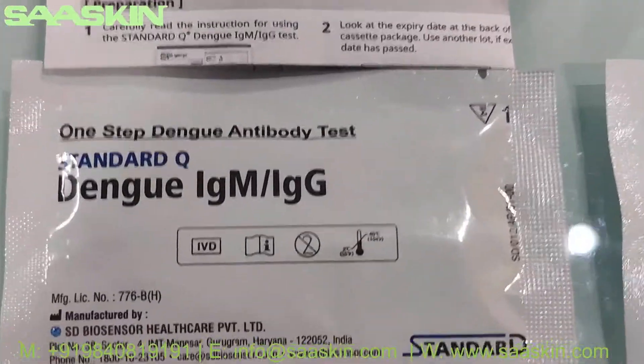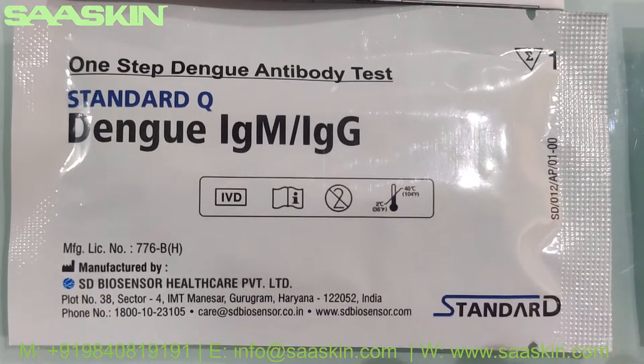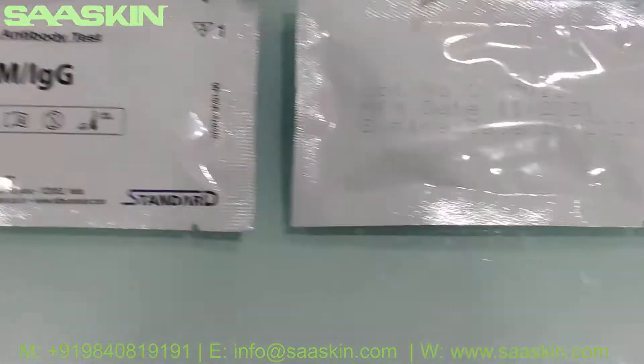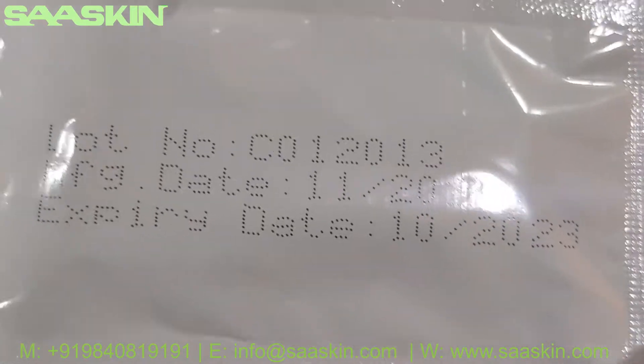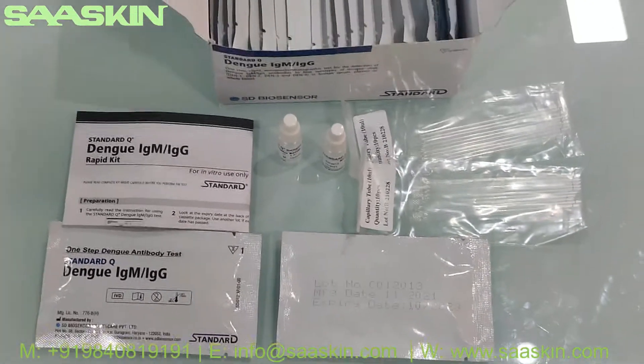This is how the test cassettes look. It reads 'One Step Dengue Antibody Test' — the Standard Q Dengue IgM IgG antibody test cassette. On the other side it shows the manufacturing date and the expiry date, which as mentioned is two years of validity.